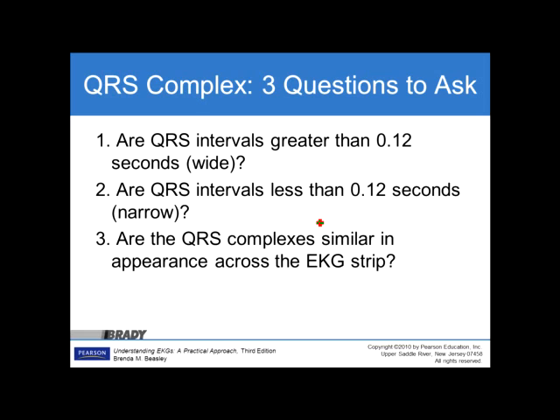Well, we're going to want to know, because if there is a section of myocardium that's injured or hurt, it may give us a different waveform. Or if it's blocked in some way, it will slow down the waveform, which in our appearance of what we're looking at on the EKG paper will make the complex wider.